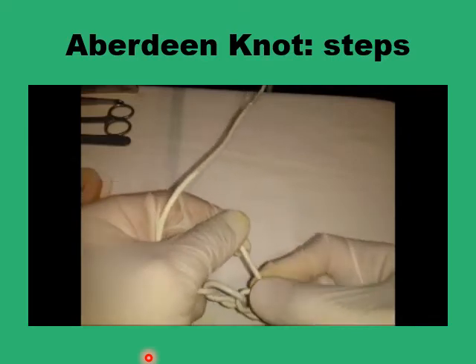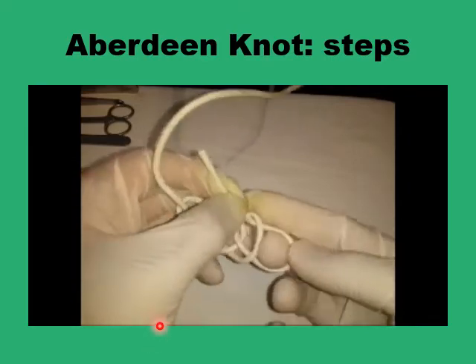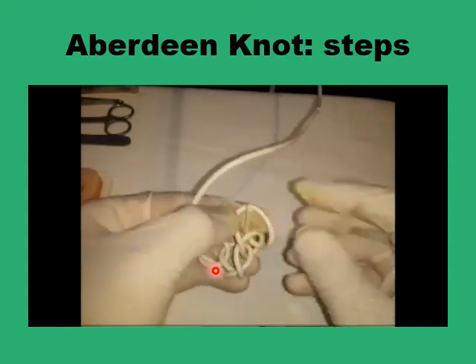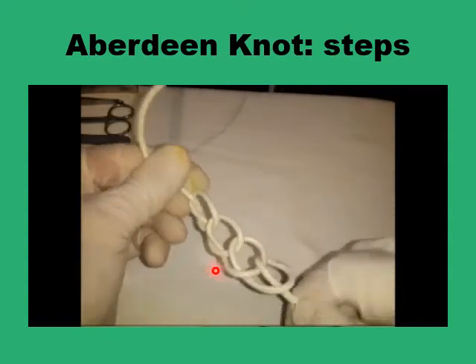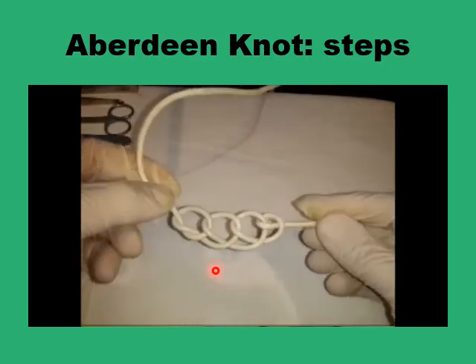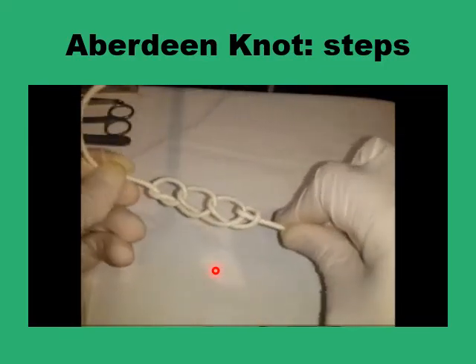Finally, you pass the needle — the final end of the thread and the needle — through the final loop, and pull on that, and you've got the Aberdeen knot, which is safe and secure.